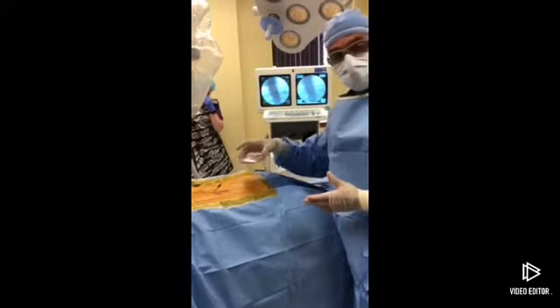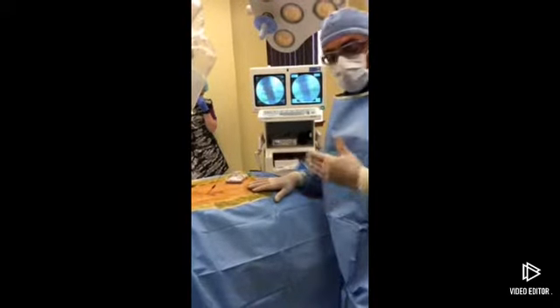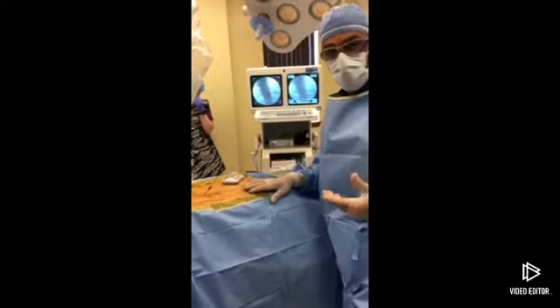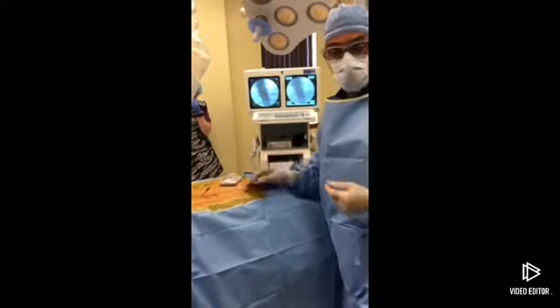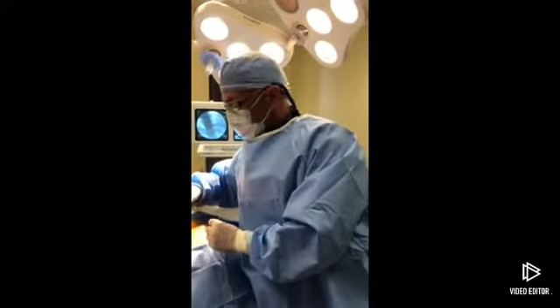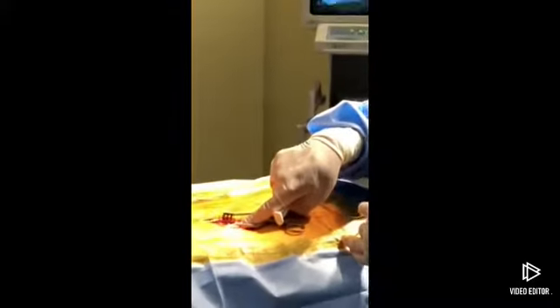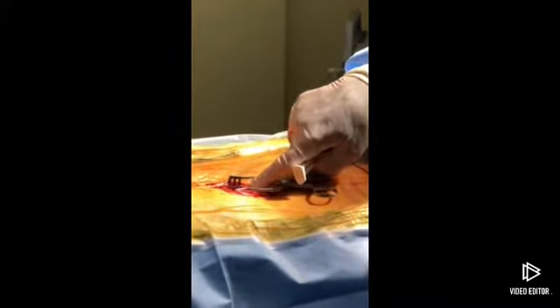She won't have something like this. It'll be a much smaller device that'll be internalized, and that battery should last for several years, and she can program that remotely with a patient programmer that we'll give her. So now, as the audience can see, we've made a little incision here, and I'm not sure if you can zoom in, but you can see there's a small incision, and this is very small. This is a minimally invasive treatment, okay? It's only about a 2-inch incision that's only about a half inch deep.